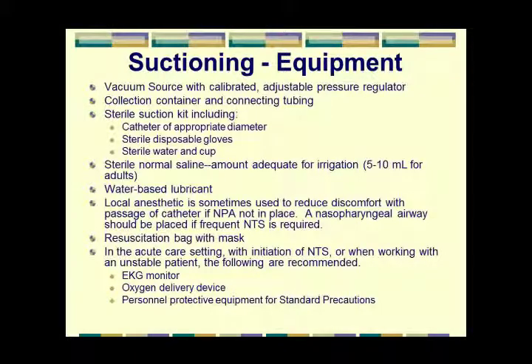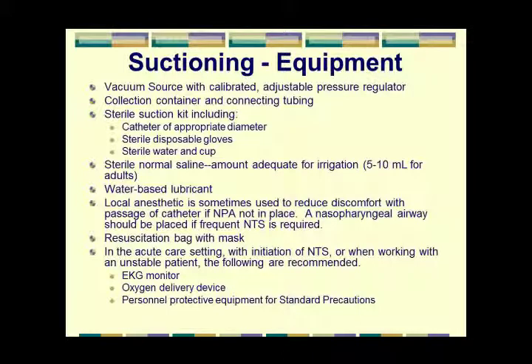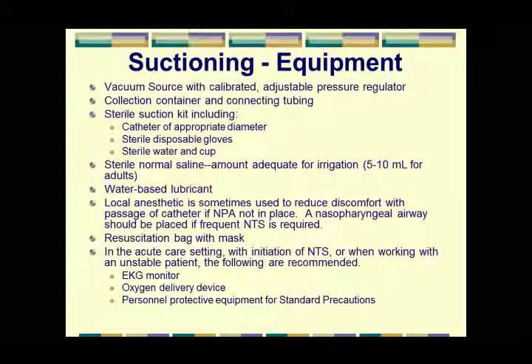Do they have 2 gloves in there or 1? I don't remember. I think most of them have 1. It's the new setup we're using. Okay. Usually it's 2, but sometimes there's only 1. Either way, one of those hands will be designated as a sterile hand. And we'll go through this.